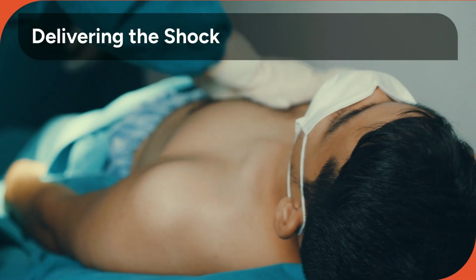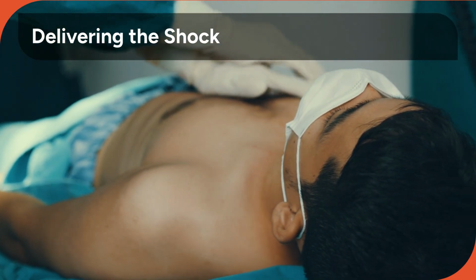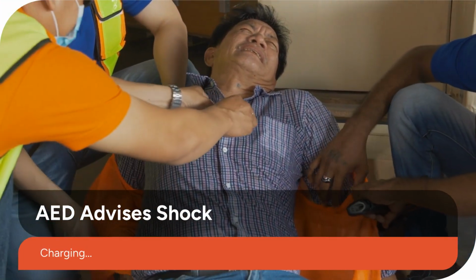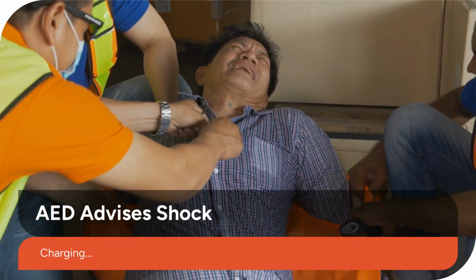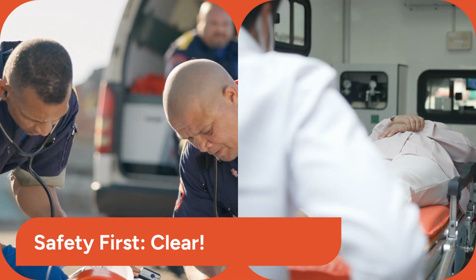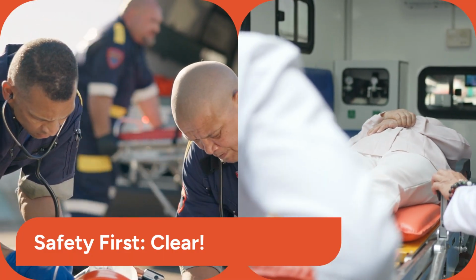If a shock is advised, the AED charges to the necessary energy level and instructs the rescuer to deliver the electrical shock. When the AED is ready, it will give a loud warning before prompting the user to press the shock button. This action delivers a controlled electrical current to the heart. Before pressing the shock button, the rescuer must loudly announce "Clear" and ensure no one is touching the patient to prevent injury from the electrical current.